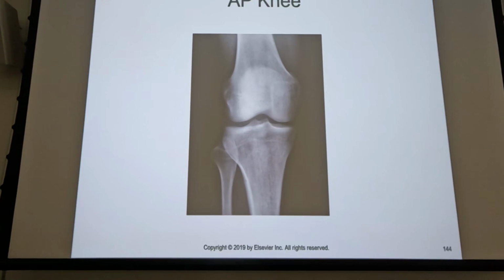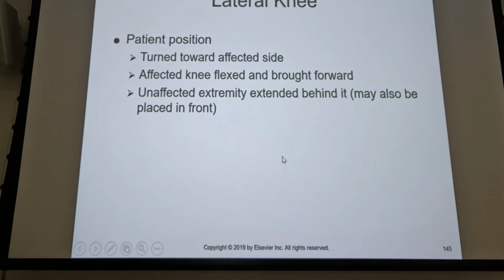So your goal in that angulation is to put the central ray parallel to the tibial plateau. Okay? So if it's not parallel to the tibial plateau, then that's what you're going to see: the front and the back of the tibial plateau. You're not going to see just a single line. But notice, you've got superimposition on the proximal end, just like what you did on the distal end as well.